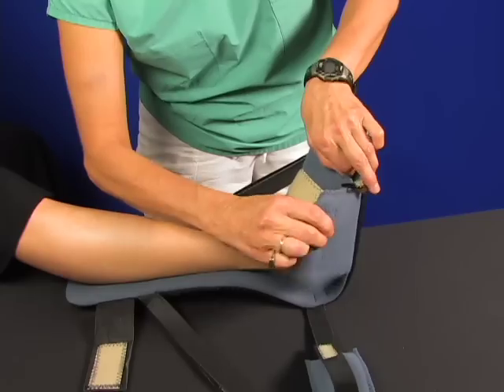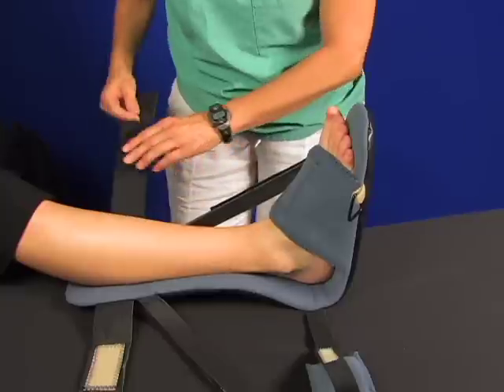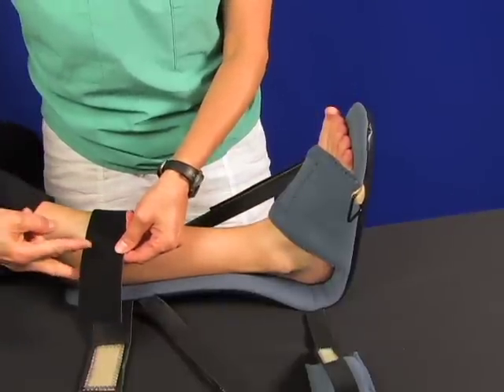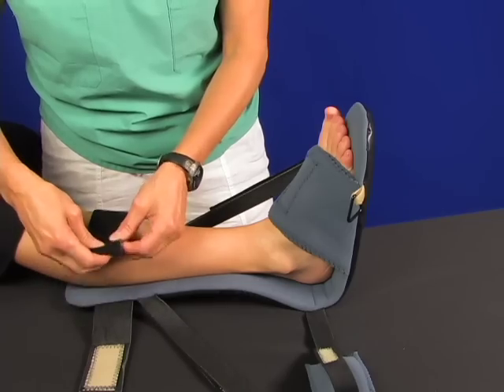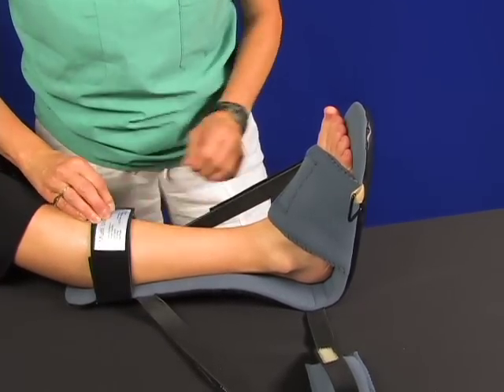First, you want to strap up the foot. Get that nice and snug. Next, you want to strap up the calf strap. You can cut the strap if it's too long or just fold it back. Snug up the calf strap for a comfortable fit.